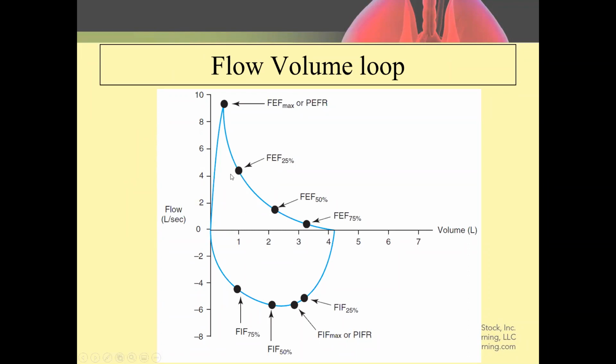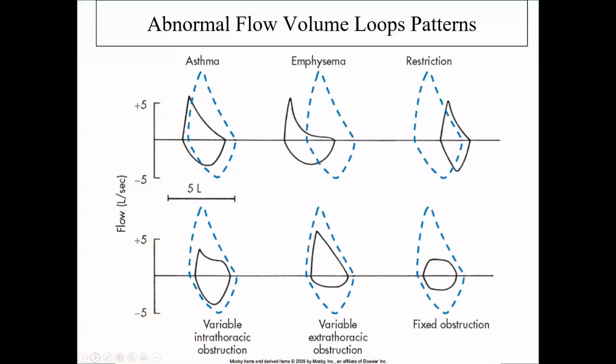The other perhaps interesting thing is the relationship between forced vital capacity and what percentage of that forced vital capacity can be exhaled in the first second. That is a big determinant of whether someone has an obstructive disorder or doesn't. And again, the key, it really is a range, 75 to 80, but if you're looking for a number, about 78% of the total forced vital capacity should be exhaled in that first second. And again, NBRC loves to ask questions like this.